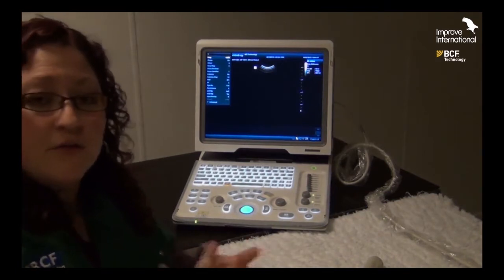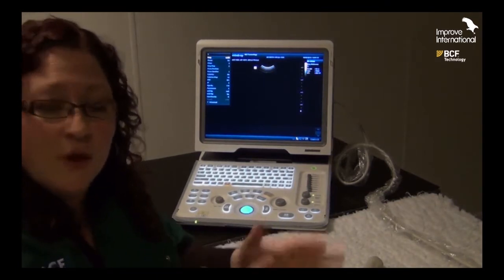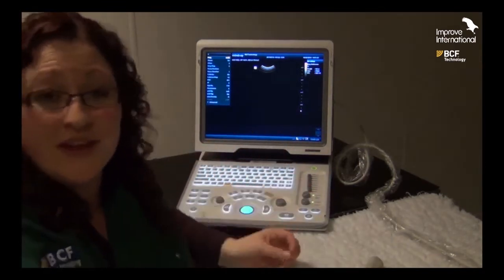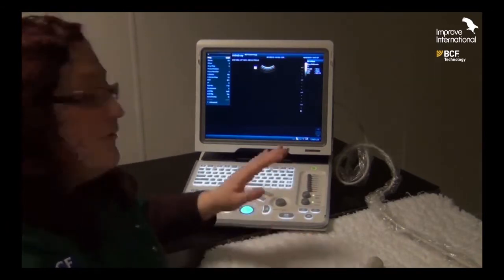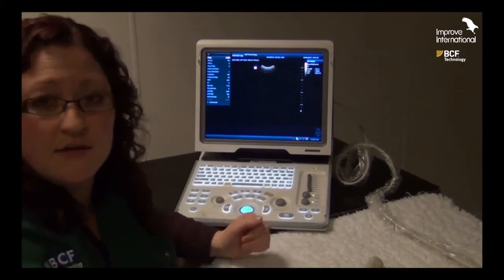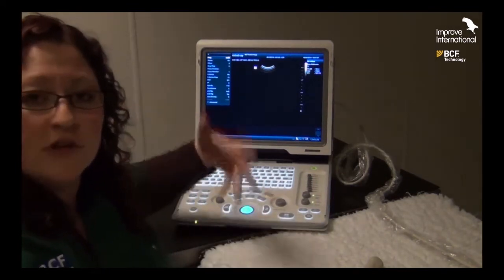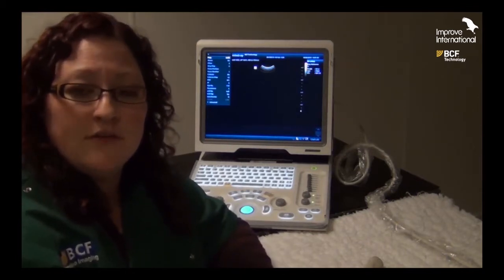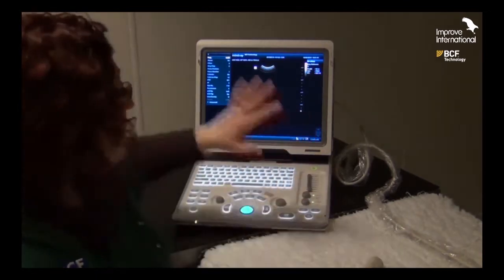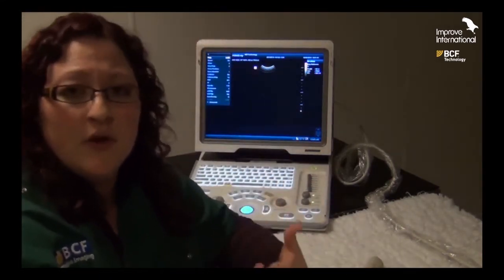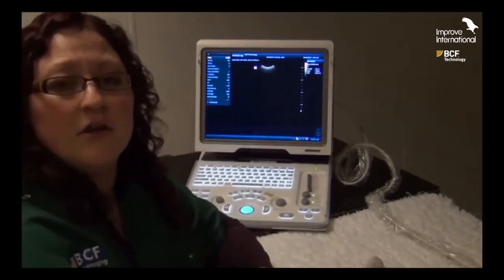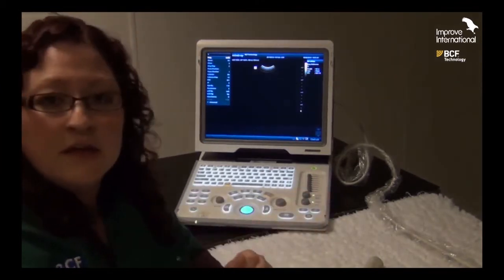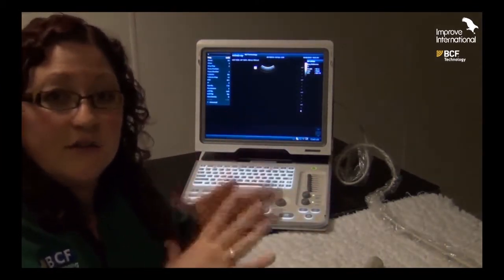Before we get started with all of the individual buttons that we can change throughout the examination, there are a couple that we need to look at which are important to alter before we even get started scanning the animal. The first of these is the preset. The preset is basically a button which allows you to choose the type of examination you will be performing. What this does is it changes quite a few of the parameters that are almost behind the scenes to improve the image quality. In essence, when you start scanning, you only have to make minor changes instead of major tweaks.